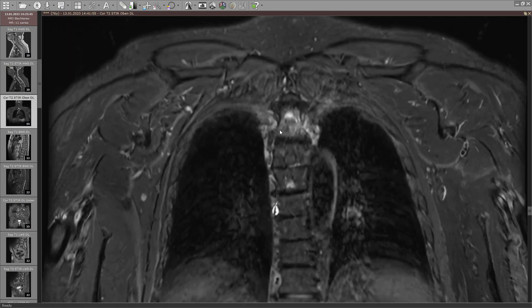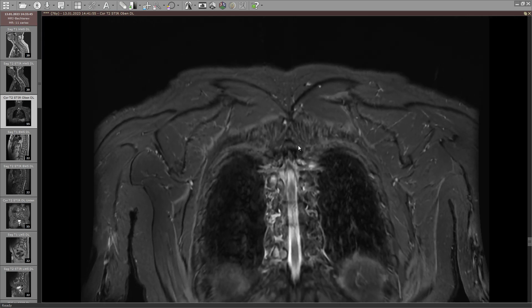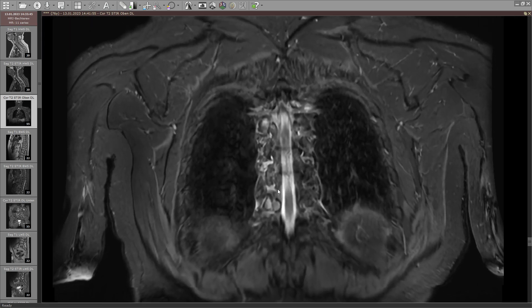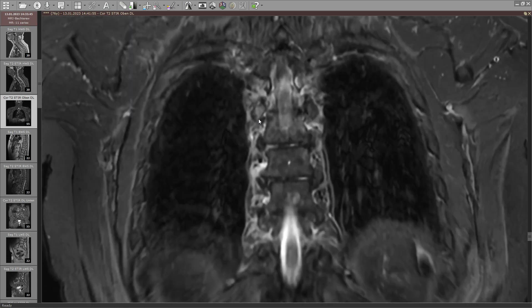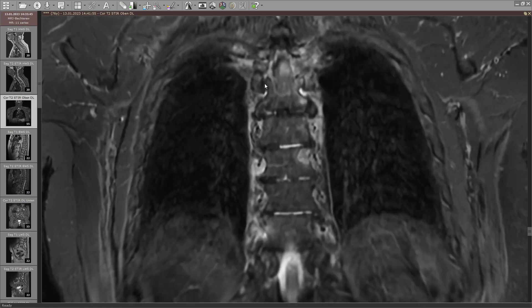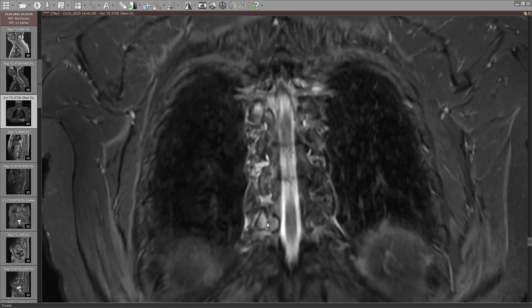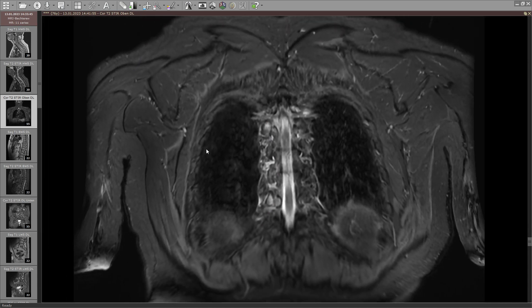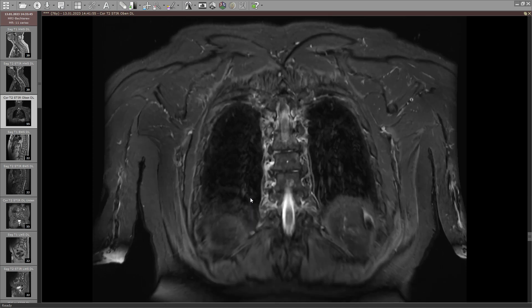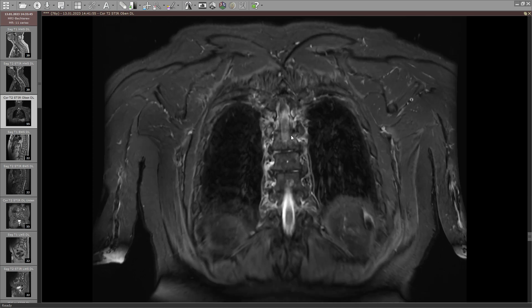Going back to the area where we had the most inflammation, you can see this bit here — this is the origin of the corresponding rib, this is the costovertebral joint, and this is where we have a lot of that inflammation happening. The ribs are coming in at the articulation here, and inflammation is also present down here and in the soft tissues on the lateral side.